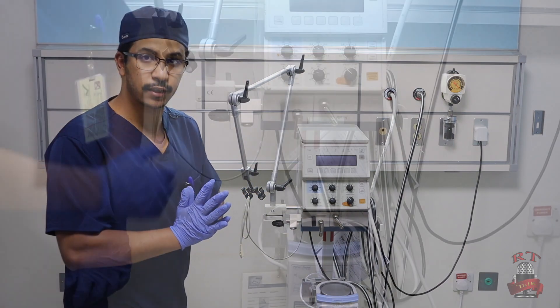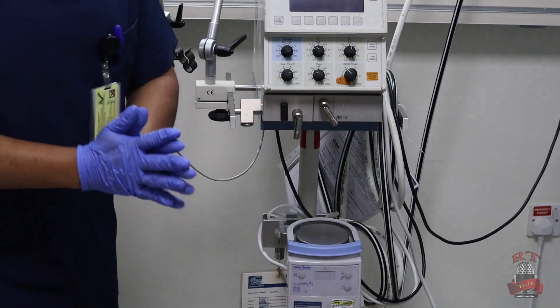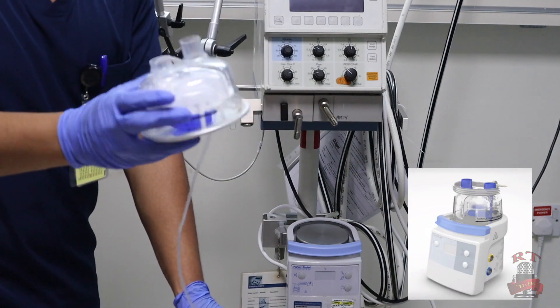Now we will show you how to set up and connect the ventilator circuit for the Babylog 8000. We already have our ventilator circuit in front of us. First, I will connect and insert my humidifier chamber.